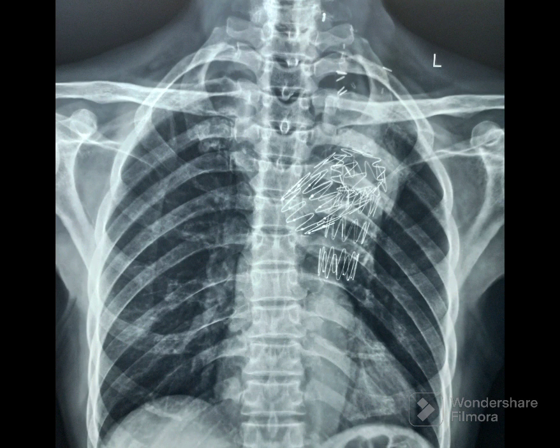TEVAR stands for thoracic endovascular aortic repair. The indications for TEVAR include thoracic aortic aneurysm and dissection. It is associated with decreased morbidity compared to open repair.